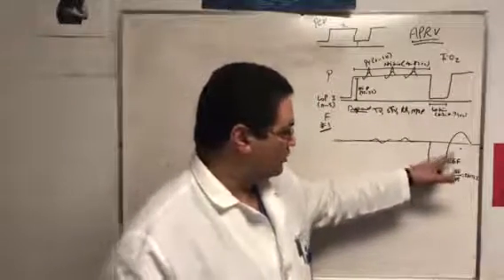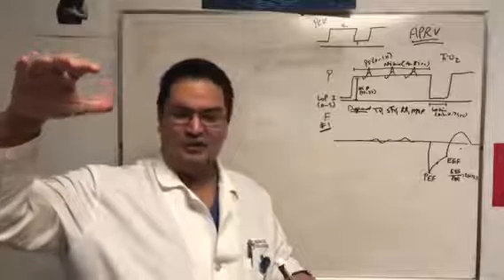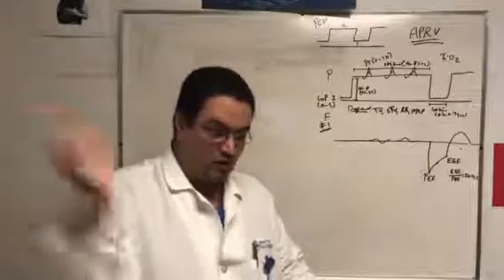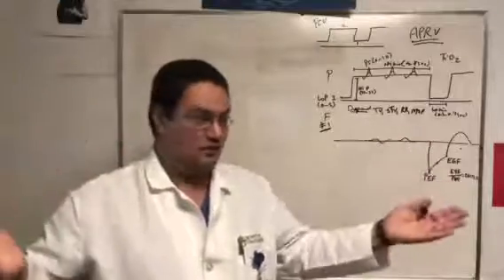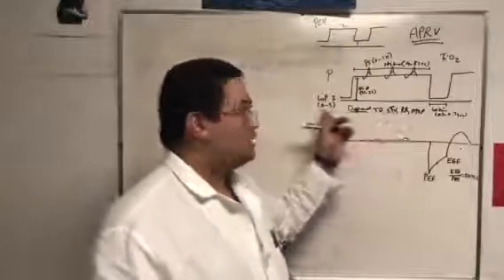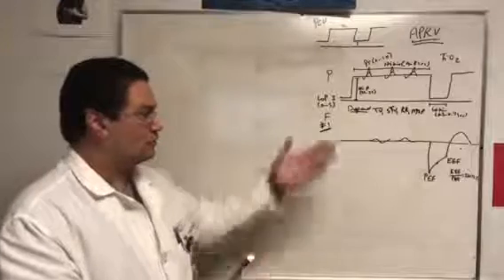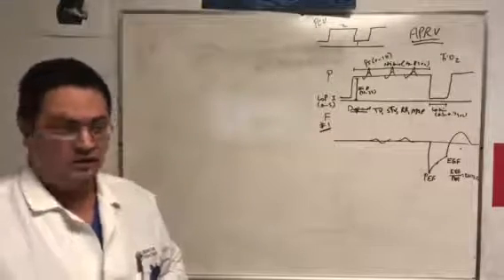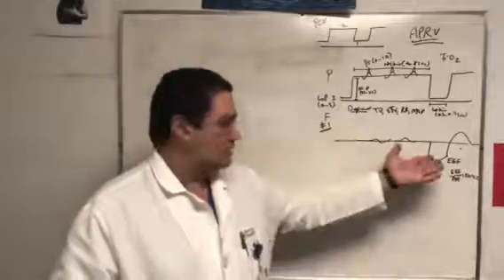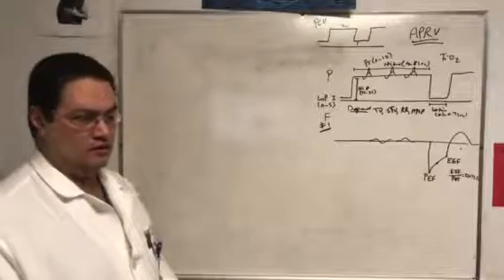Let me tell you, if this thing reaches all the way to zero flow, it's the hurricane theory, right? The hurricane analogy. You have the high pressure area and the low pressure area, and it just keeps on flowing until the two pressures equalize. So if you allow this to go all the way to zero, where there is no flow anymore, the hurricane stopped, that means you allowed the lung to see the low pressure. Now the lung experienced 0 as a low pressure, or 5 as a low pressure, which is extremely low for somebody with ARDS. That will collapse everything. That's horrible. So in essence, the lung never sees the low pressure in this mode. We don't allow this to reach all the way to the baseline. That's the whole essence of using the auto PEEP to your advantage.